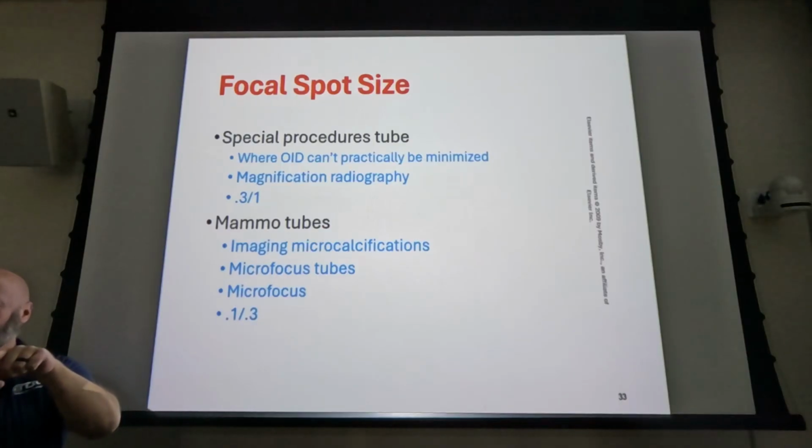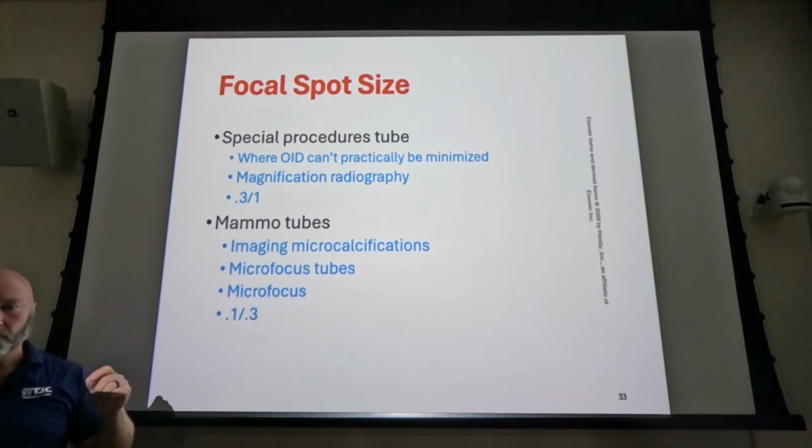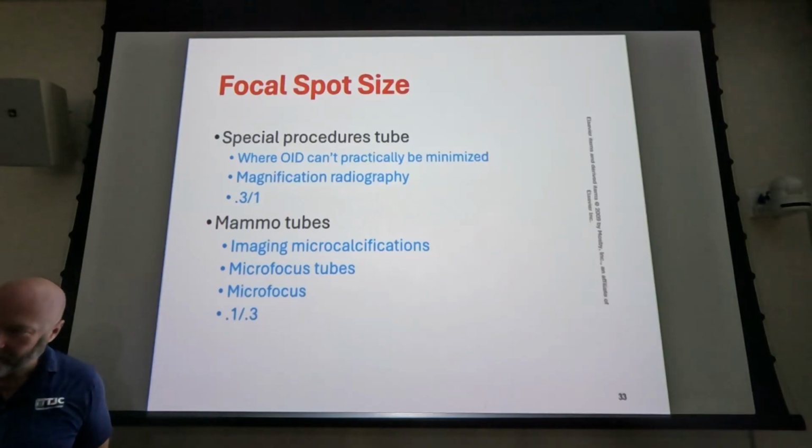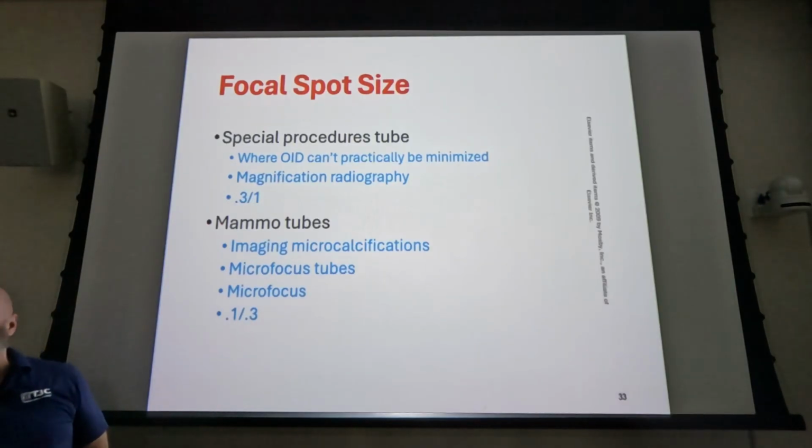So they can rock it a little bit and keep that anatomy right where they need it to be. What they do in special procedures sometimes is use what they call coils, and they'll reinforce aneurysms in the small vessels in the brain. So you think it's important to be able to focus on that small anatomy and move just a little bit and not have to reorient your entire C-arm? And the answer is yes.